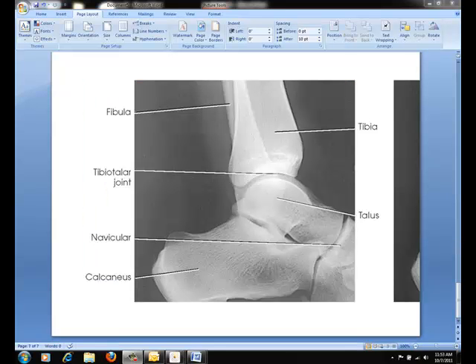The resulting image shows a true lateral projection of the lower third of the tibia and fibula, the ankle joint, and the tarsals, including the base of the 5th metatarsal. Be sure that the tibio-talar joint is well visualized with the medial and lateral talar domes superimposed. Also, be sure that the 5th metatarsal is seen so you can check for a Jones fracture.